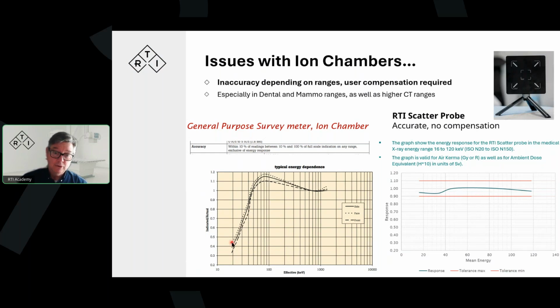Then of course it's easy to say that that's so low radiation, we don't need to worry about it. Well, have you actually compensated the values that you're looking at? Have you estimated what the energy spectrum is, the mean energy? Have you done that? And are you doing a proper reading? Do you know how to compensate for it?